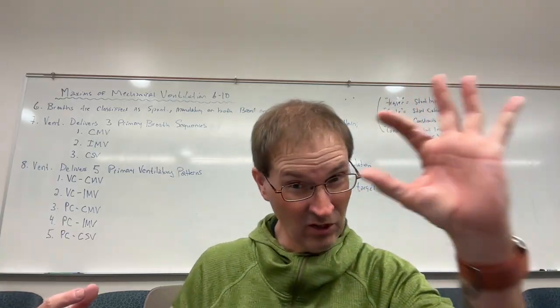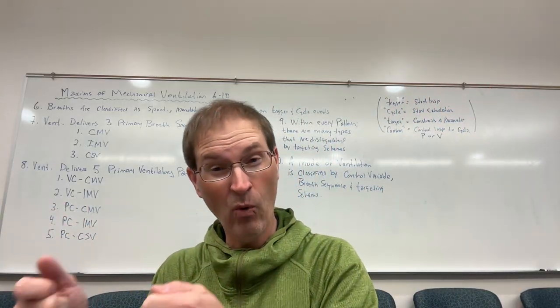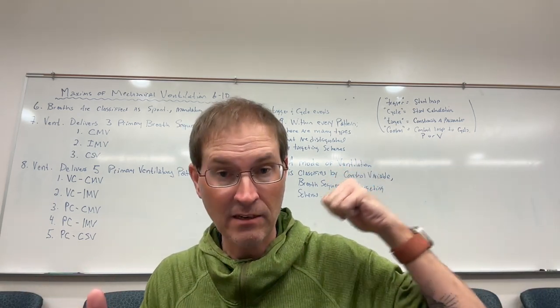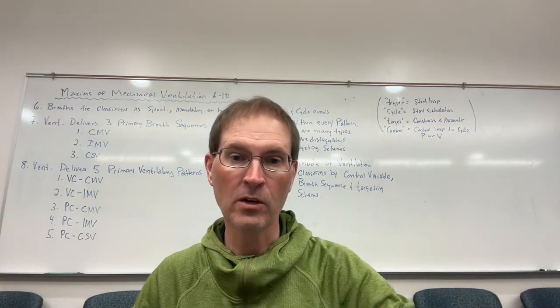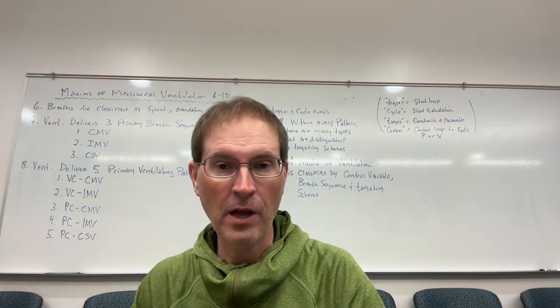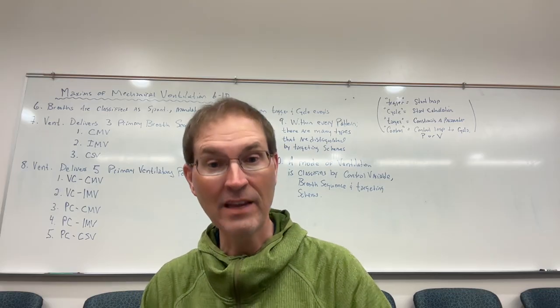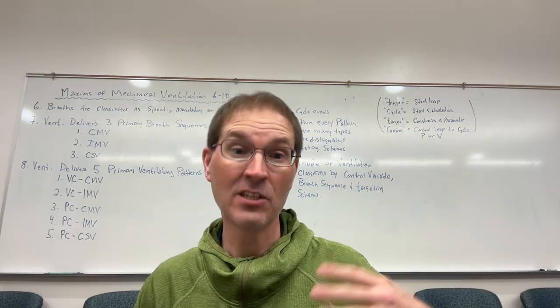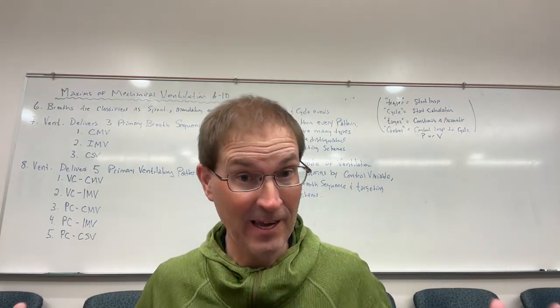What you can do is you can look at that, and then you can look in the manual for the ventilator and go, okay, what does that mode actually do? And you can relate it back to these videos and go, oh, okay, this is what this super duper volume comfortable NAVA pressure mode number 12 is actually doing physiologically, and I can understand what the mode is and when, how, and why I would want to use it, okay?